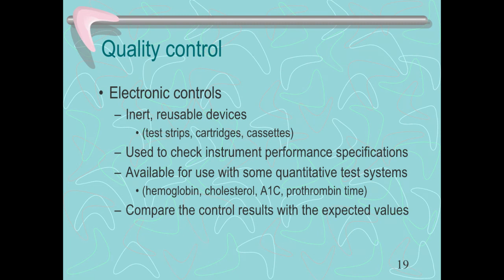So you may have a high and a low concentration solution. You may just have a cassette that just says it's your control and you run it. Sometimes it just runs itself, like I said, and then you print those values or document those values.